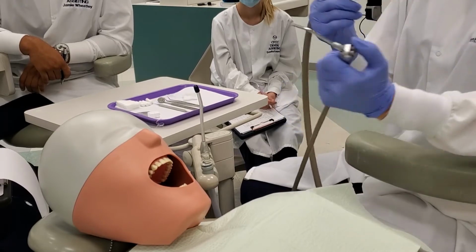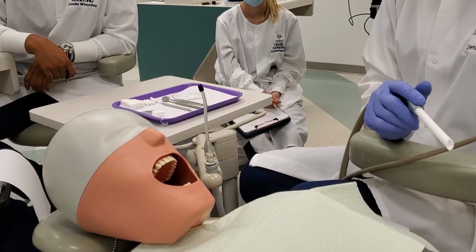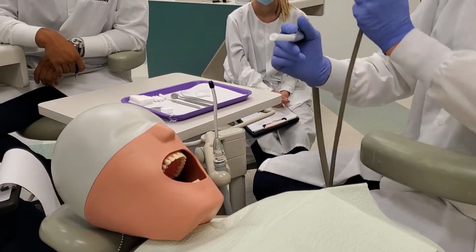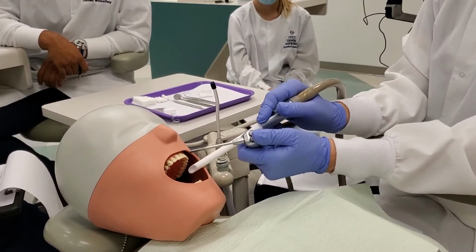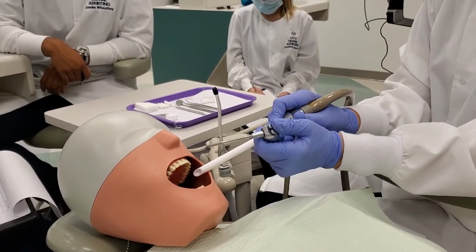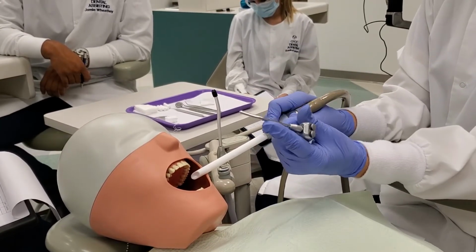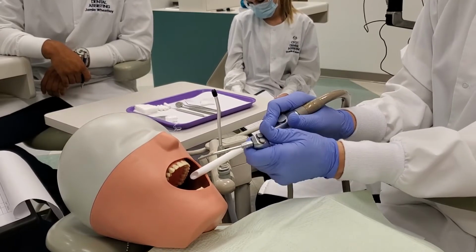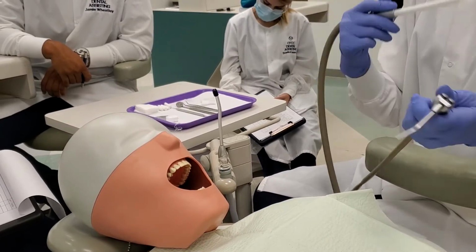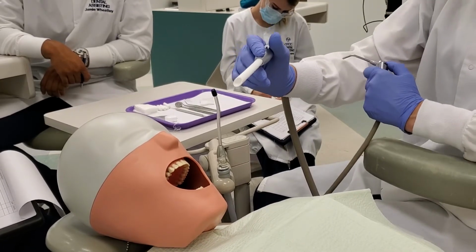If I tell you to just dry a tooth, and you've already used this for rinsing, make sure outside of the patient's mouth, you want to clear that line. Because if I'm asking you to dry a tooth, and we're getting ready to bond, we've just got done etching, and you're getting ready to bond, you have to keep that tooth dry. So if you go to dry it, and if this has been used, there's still water in the line. When you push that air button, a little bit of water is going to come out. So then you have to re-isolate, re-etch, do everything all over again. So always make sure if you're just drying a tooth, you're clearing the line first outside.